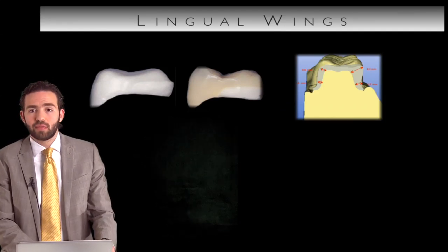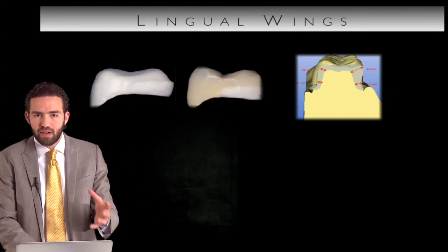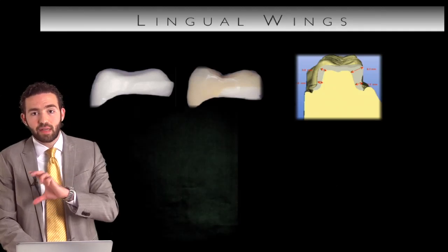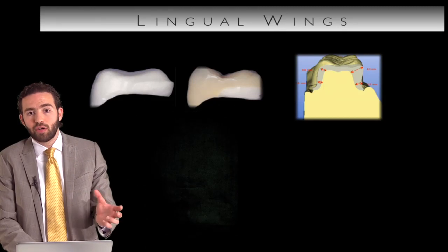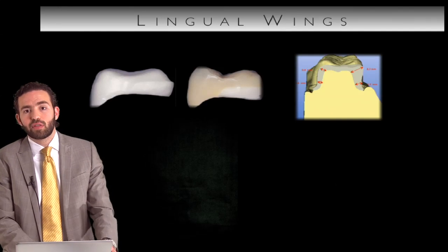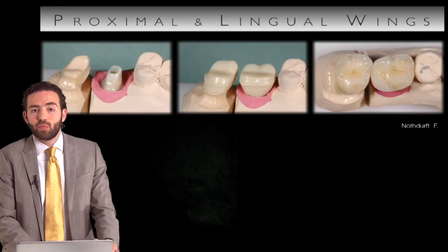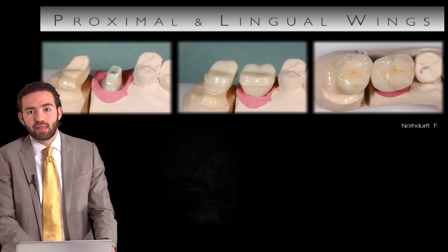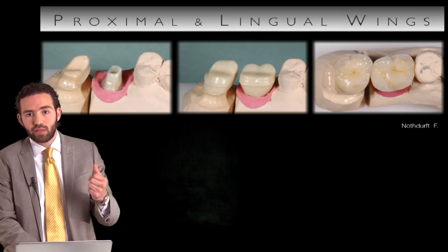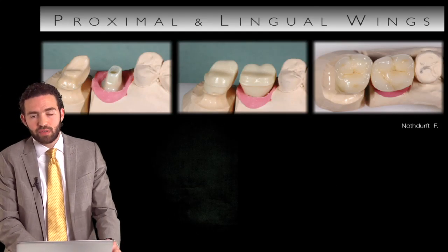What about lingual wings? We can provide a thick lingual collar, especially on the maxillary teeth where the functional cusp is the palatal cusp. And we can provide a thick lingual collar on the palatal cusp that can give us extreme good support for that particular cusp. What about providing proximal and lingual wings at the same time? All around. Make the best out of the white or the tooth-colored restoration zirconia and give even support for the porcelain on top of it.